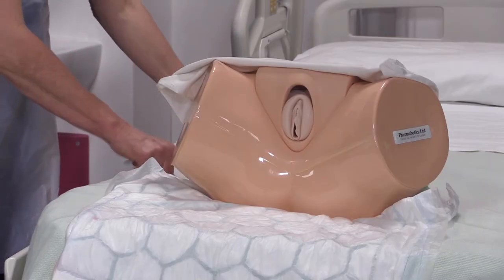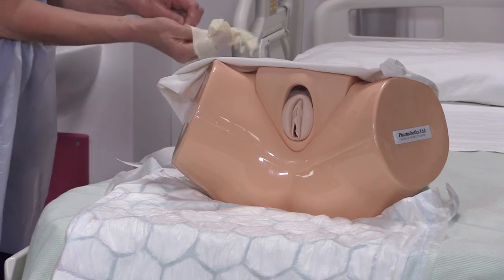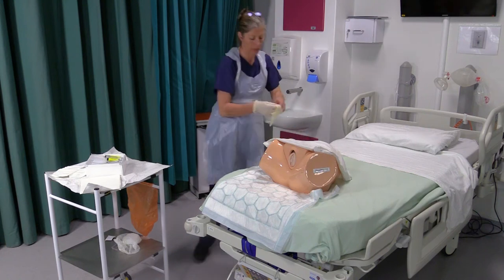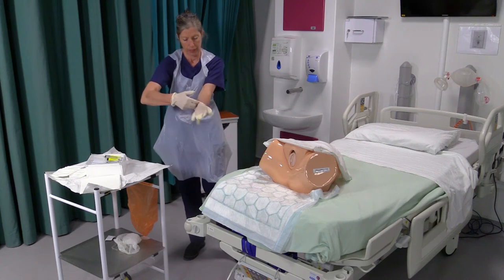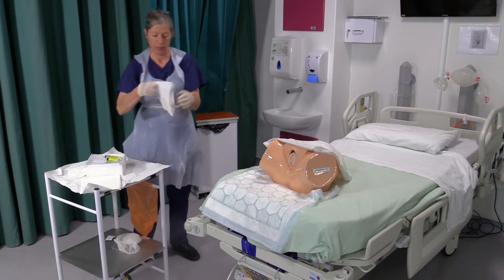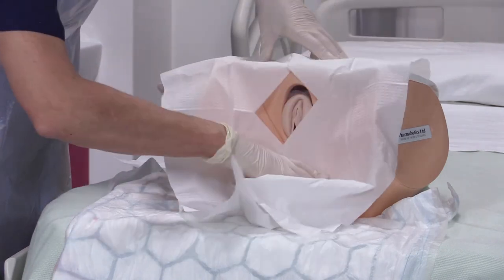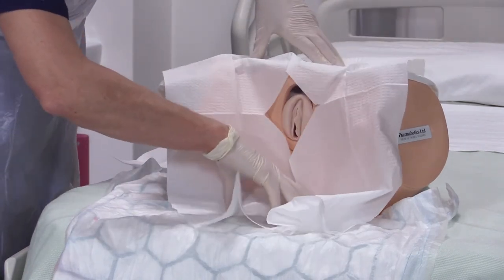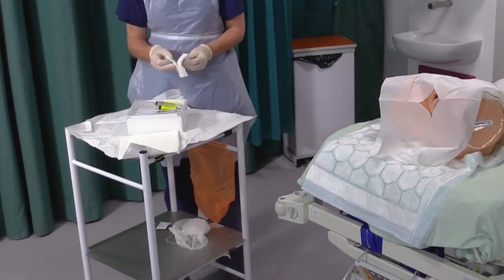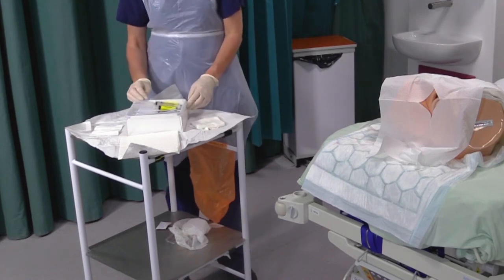Now put on your sterile gloves. Cover the patient's thighs and buttocks with a sterile paper towel. And to obtain good visualization of the urethral opening, it may be helpful to place a pillow under the small of the patient's back or ask if they can put their hands underneath their buttocks to lift their pelvis.